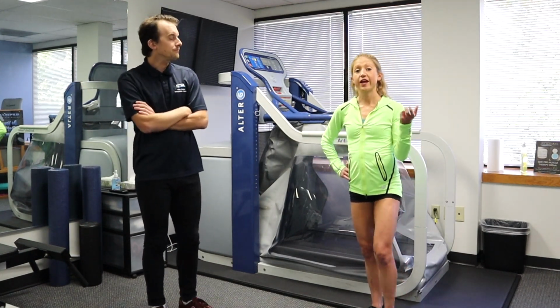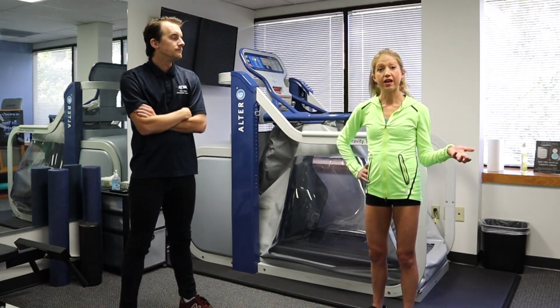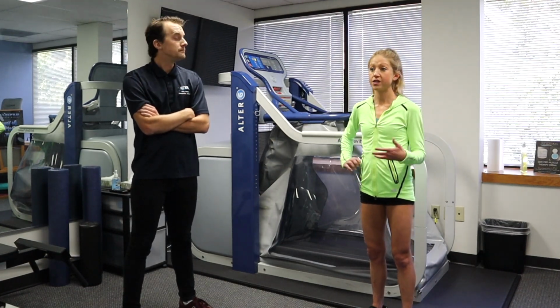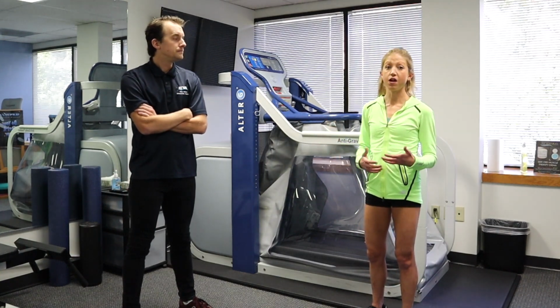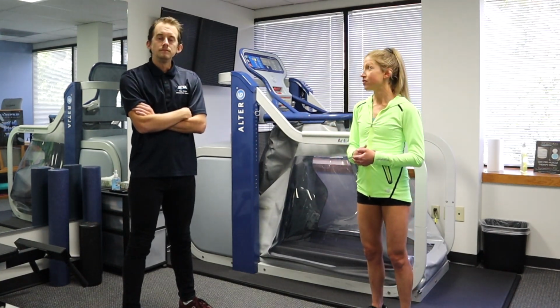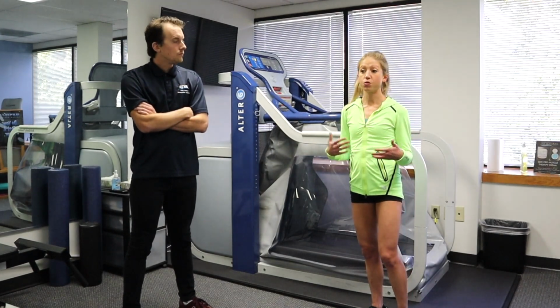I've also seen clients and patients that are obese and they're unable to do a lot of walking because of the impact on their joints. And so they use the AlterG to walk so that they are able to lose weight and gain fitness until they're ready to transition into walking in the real world.